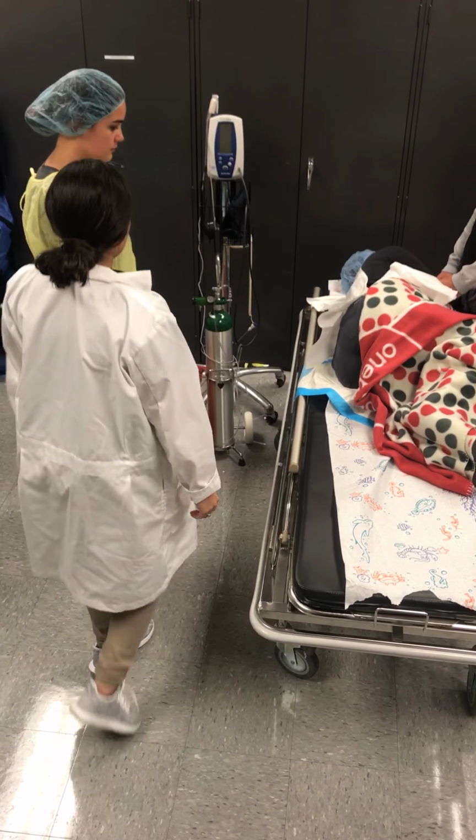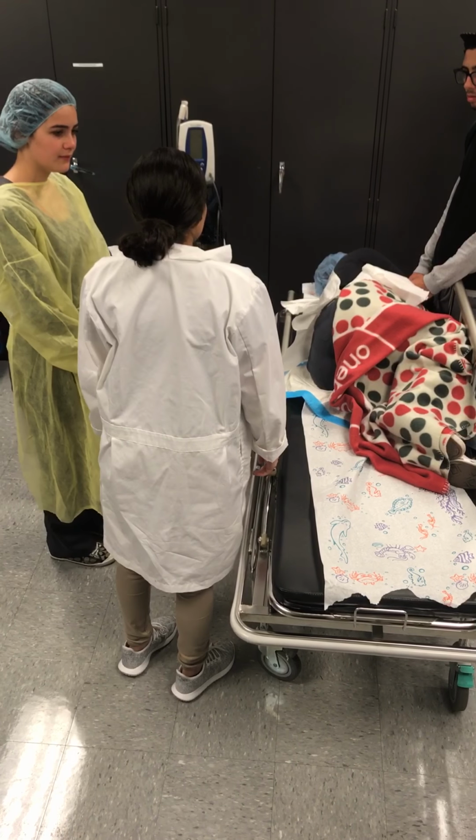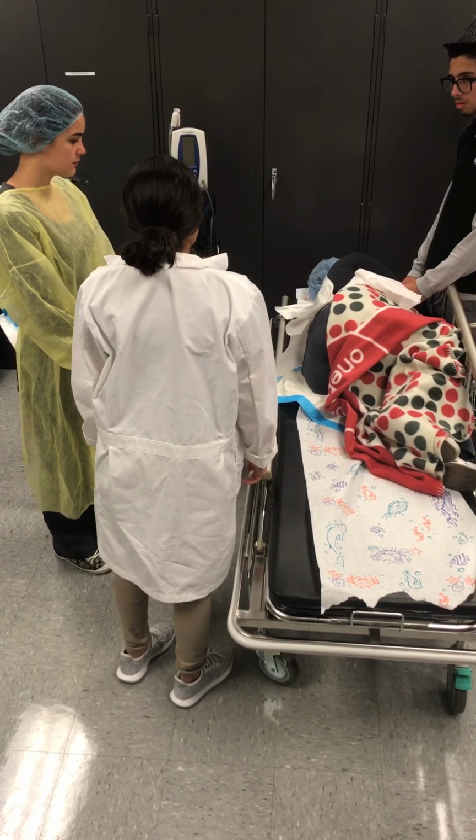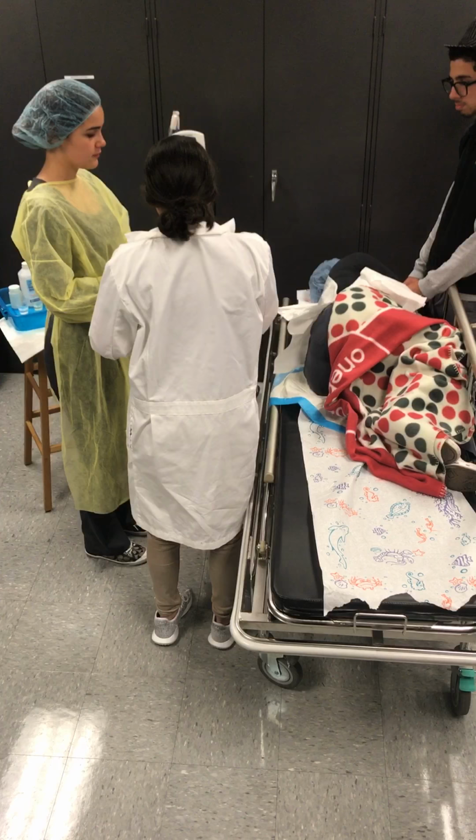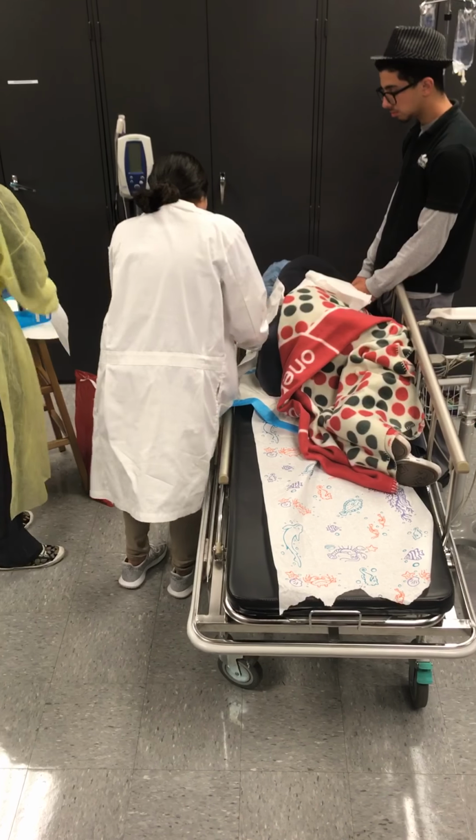Assist the provider as needed. Hi, Ms. Rodriguez. My name is Dr. Cass, and I'll be your doctor for this procedure, okay? Provides provider with butterfly needle. Take a deep breath in for me.